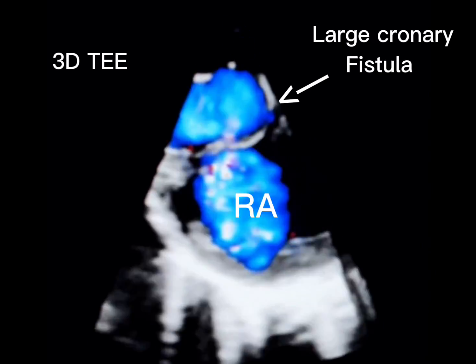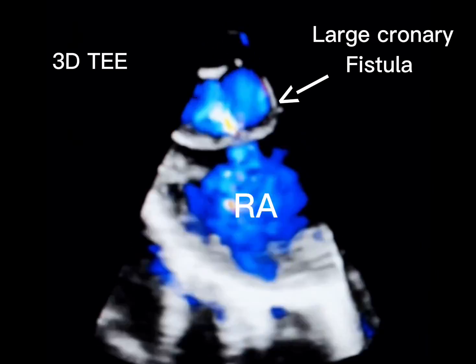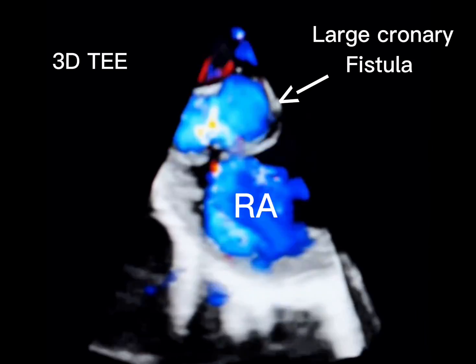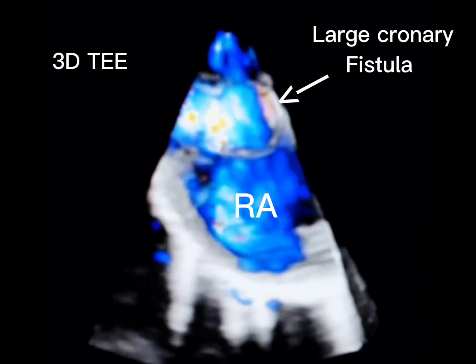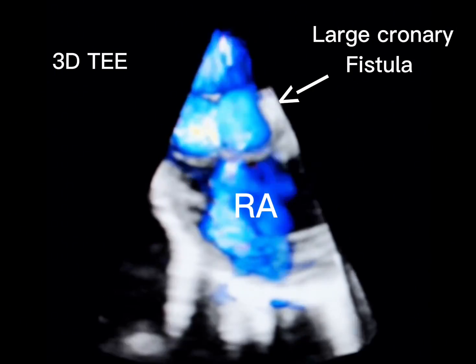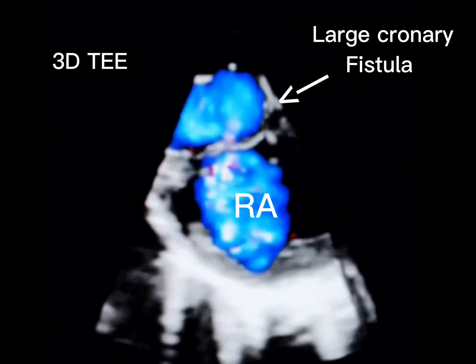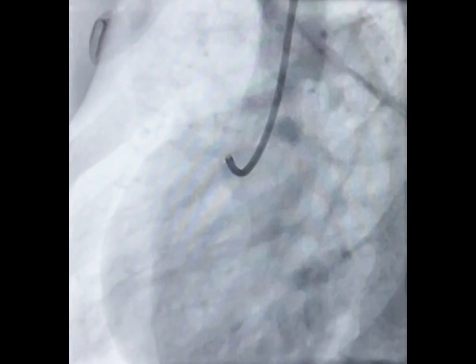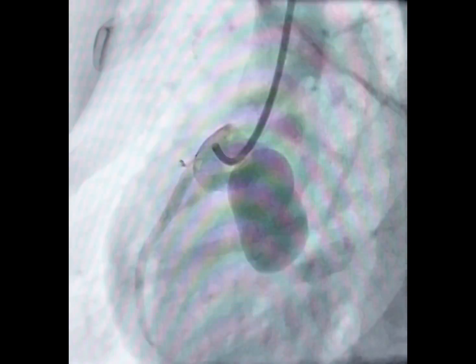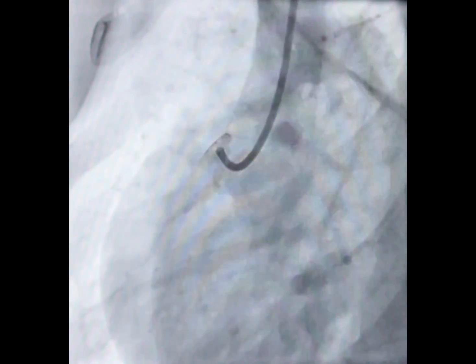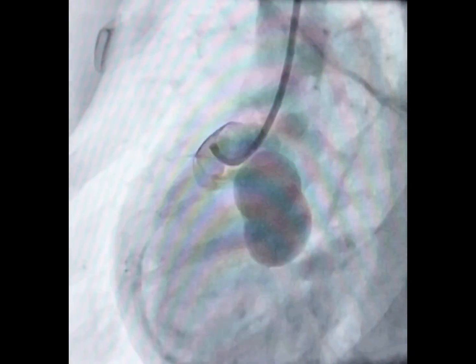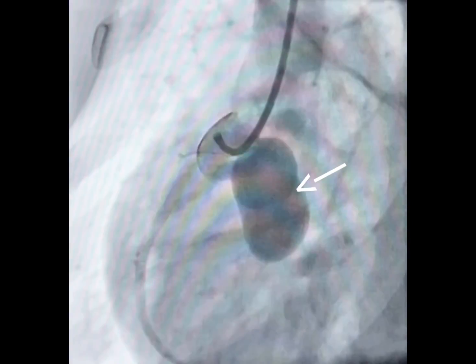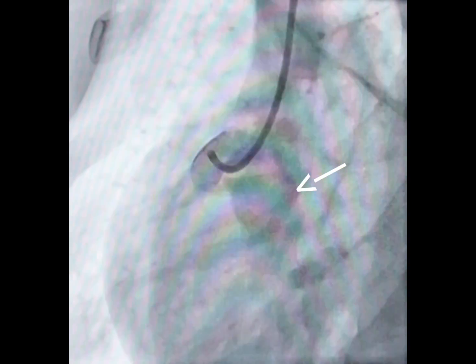Large coronary fistulas progressively dilate due to chronic high-volume runoff from a high-pressure coronary system into a low-resistance chamber, resulting in flow-mediated arterial enlargement. This coronary angiogram of the patient shows the RCA with a large aneurysmal coronary fistula.